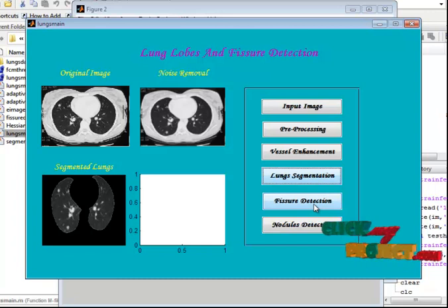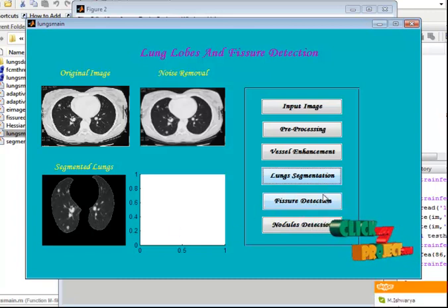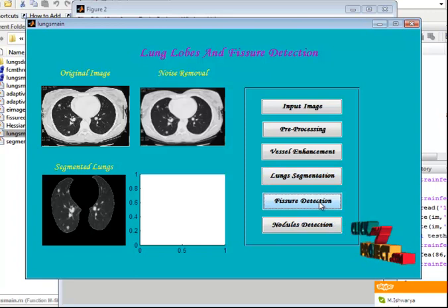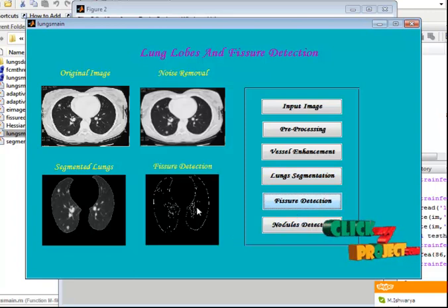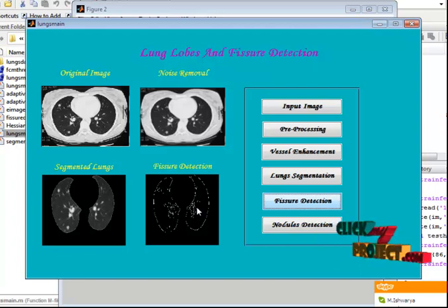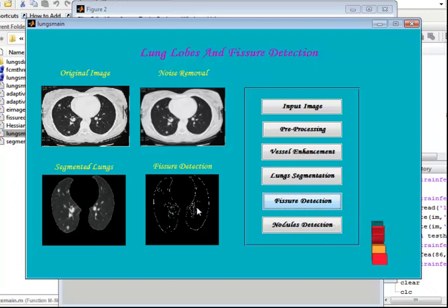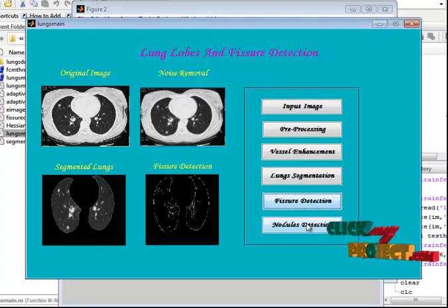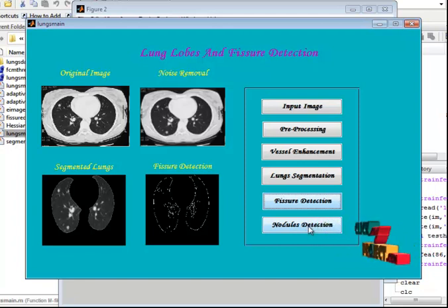Here we are detecting the fissures in the lungs. The detected fissure regions are displayed in the fourth axis. For detecting fissure regions, we are using the fissure sweeping method. Here the nodules are detected in the CT image — now let's see the result.